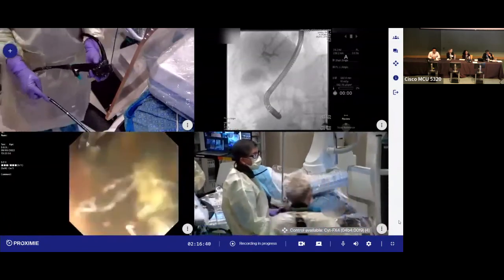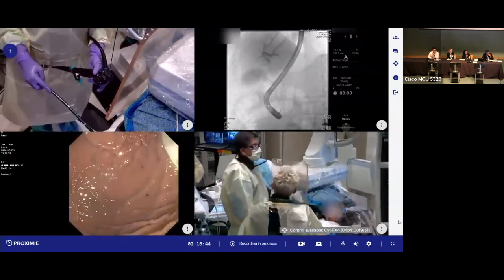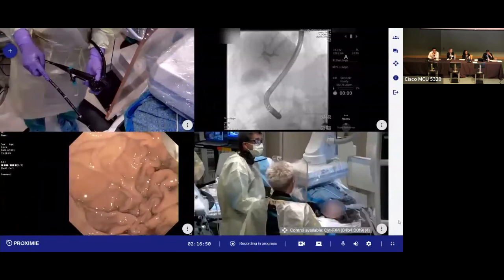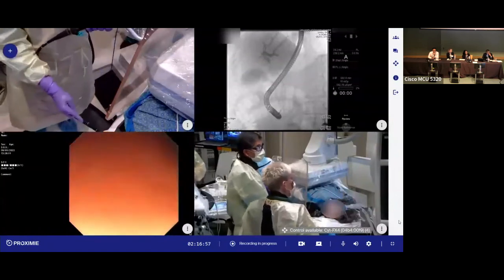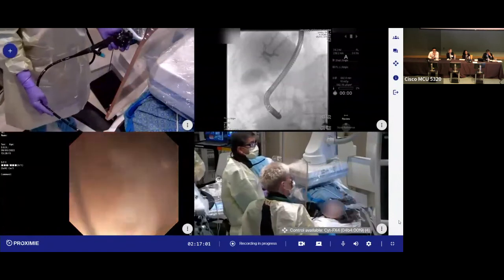What we ended up saying is that you can't always do a single modality. About another third of patients need multimodality intervention with balloon dilation, mechanical lithotripsy, cholangioscopy, EHL, laser. So you have to have all that armamentarium at hand and have experience in it to adequately treat.